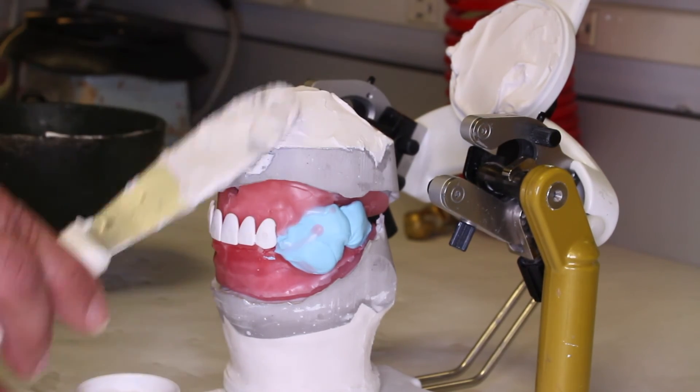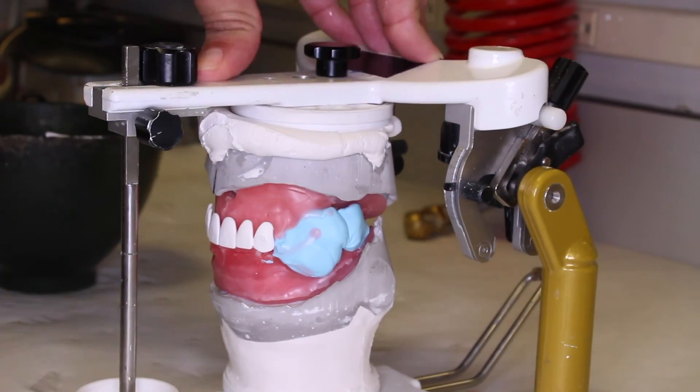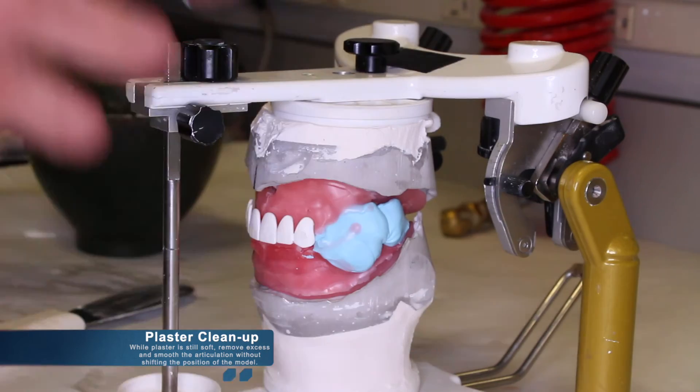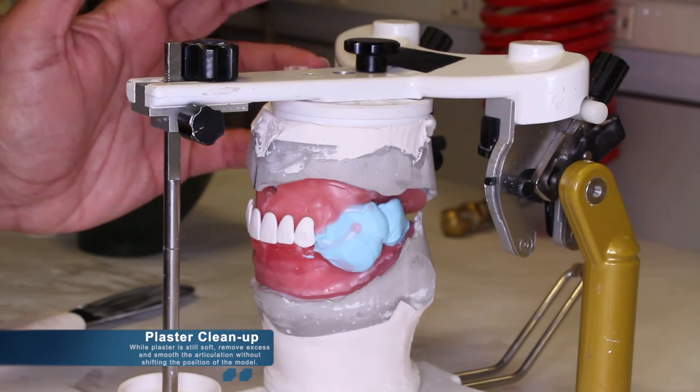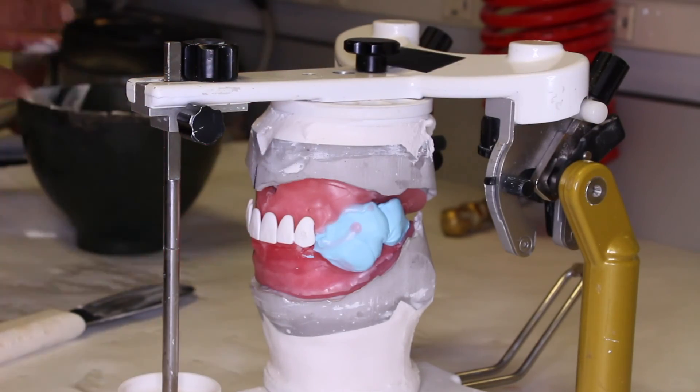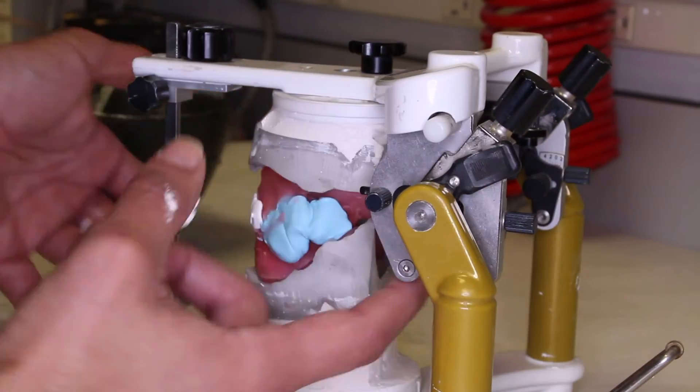The plaster should be stacked in order to reach the mounting plate on the maxillary portion of the articulator. The plaster can then be cleaned. Once the plaster is clean and set, the articulation is complete and we are ready to move to our next step in the denture fabrication process.